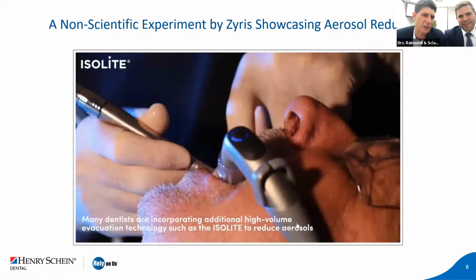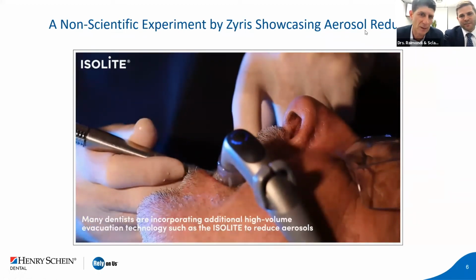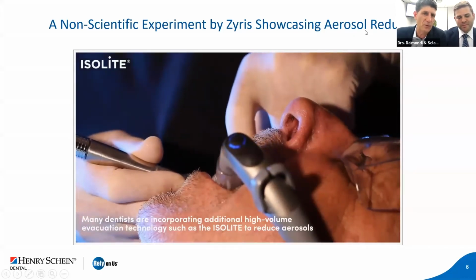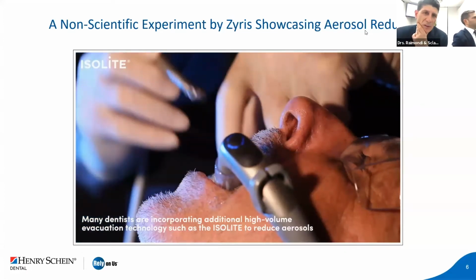So here's a video that was showing a preparation. There's no assistant in this video. A lot of times during my preparation, my assistant is setting up for what's next, whether I'm placing cord or making provisionals. Most of the time I can work without an assistant. However, sometimes I will still have her there with her high volume evacuation, but I'm not concerned about the patient. If I'm removing a crown, I'm not concerned about them swallowing any materials. This is blocking the tongue, blocking the cheek, protecting the airway, and getting it done.